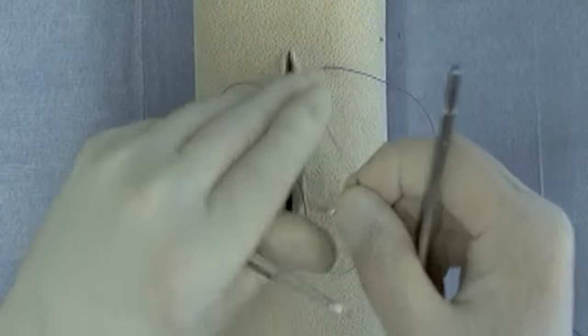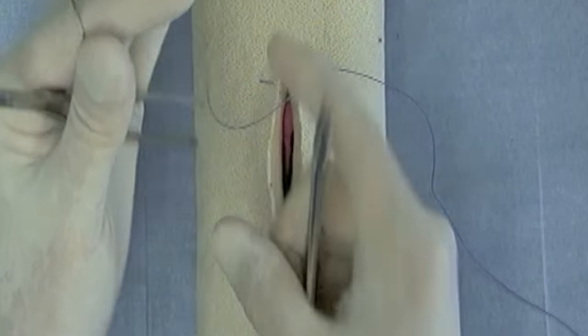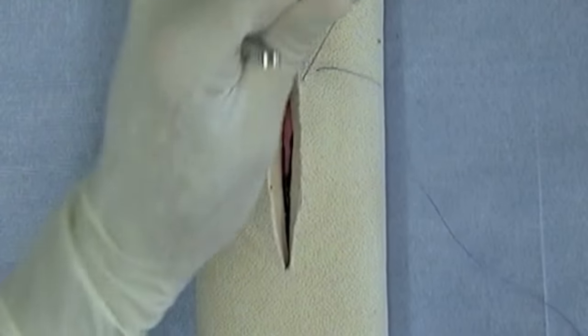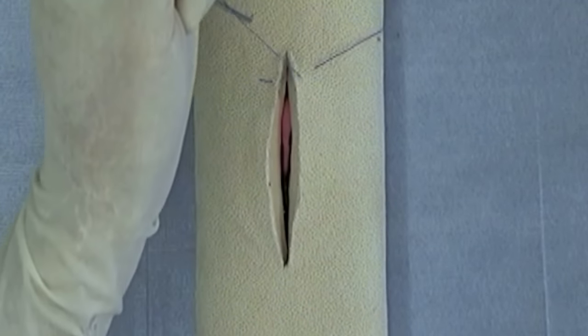Now notice that I have grasped the needle with my left hand, my thumb forceps are in the left hand, and now I gather the suture in order to complete the tie.